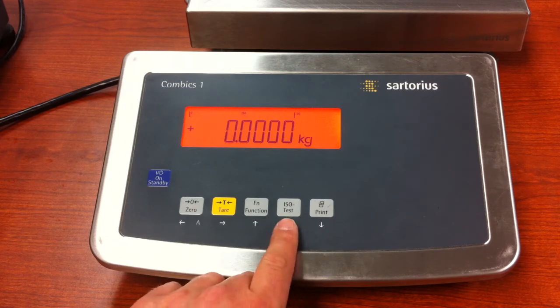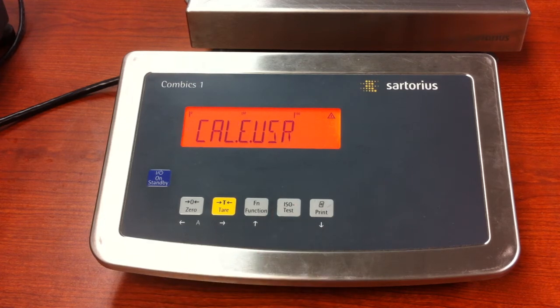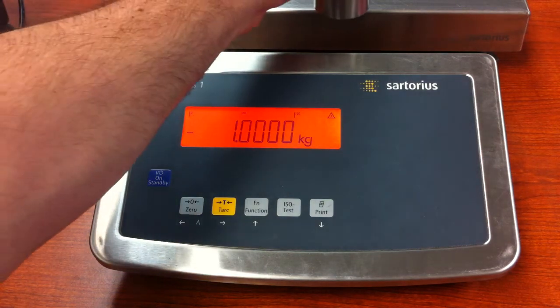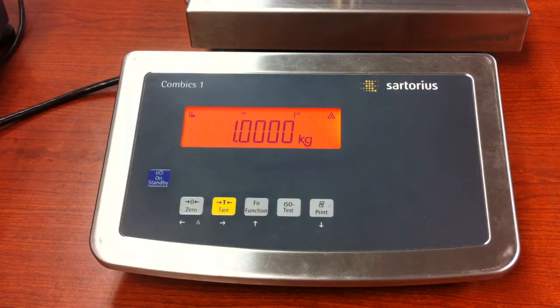Then press and release the ISO test key — do not hold, just press and release. It will then prompt you for the calibration value. At this point, simply place your calibration weight on the platform, and the unit will show you the deviation.